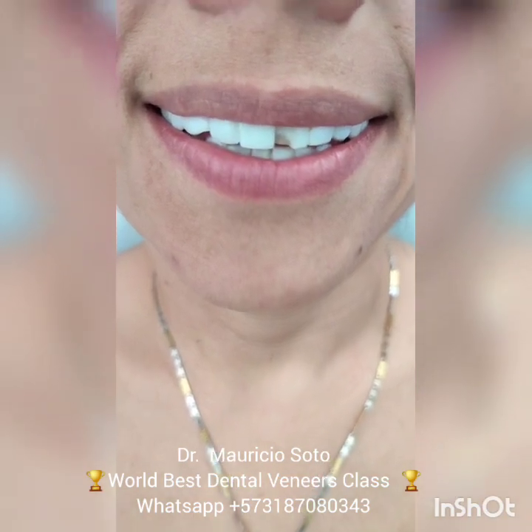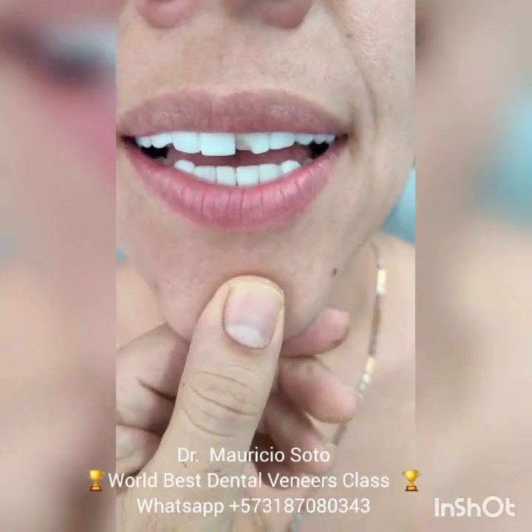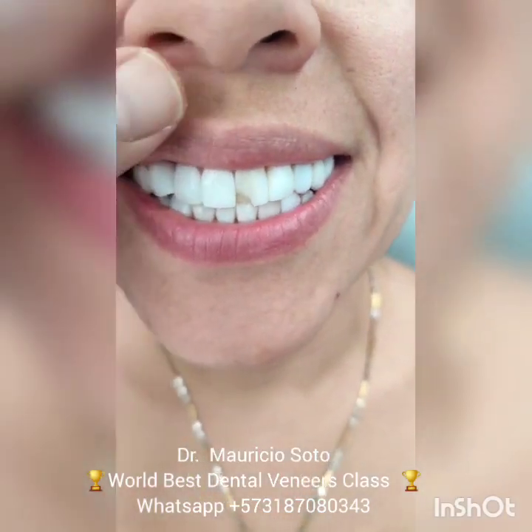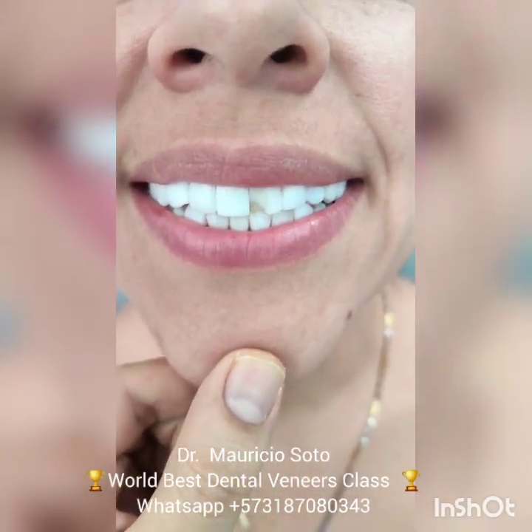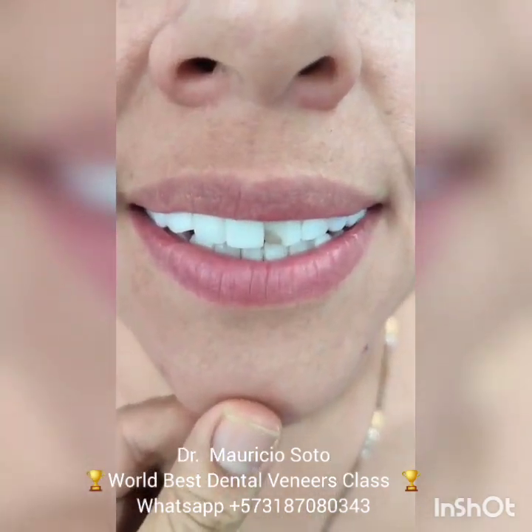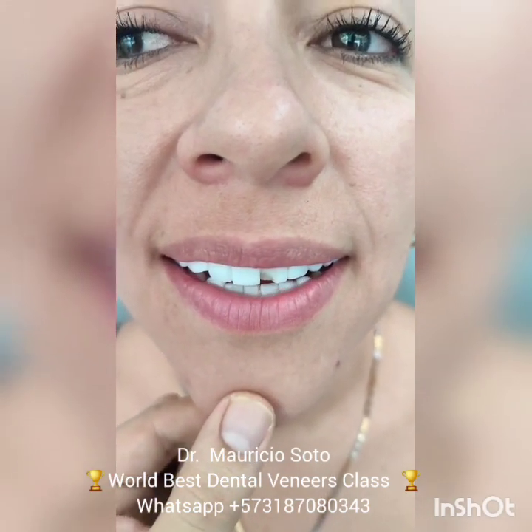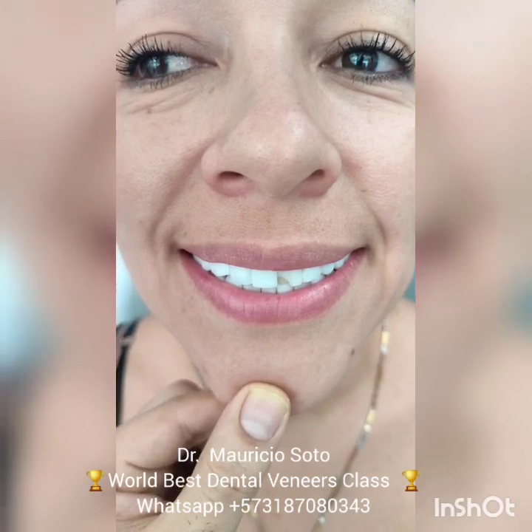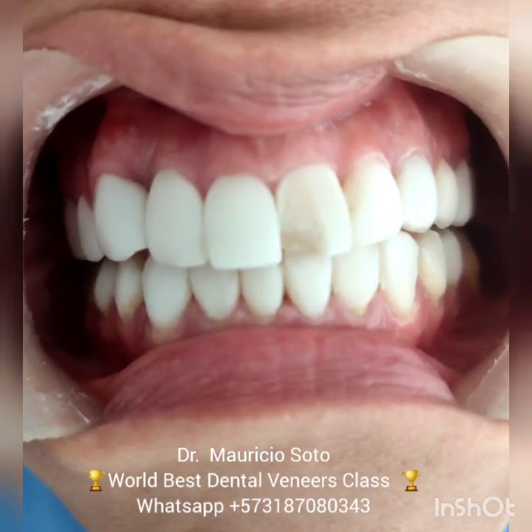Sometimes patients bite hard things — for example, bones or pieces of ice — and fracture the veneers. When this happens, we need to solve the problem and repair the veneers. It's also important that the patient use a night guard because many people have bruxism. For this reason, it's important to use a night guard at night.